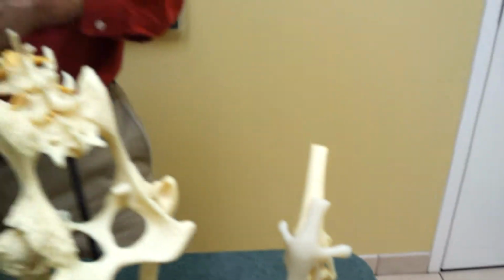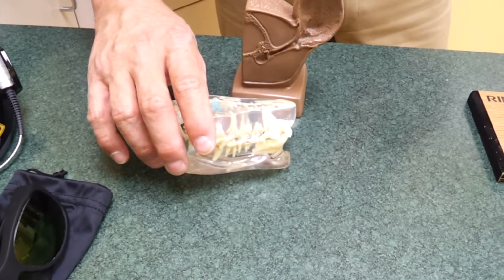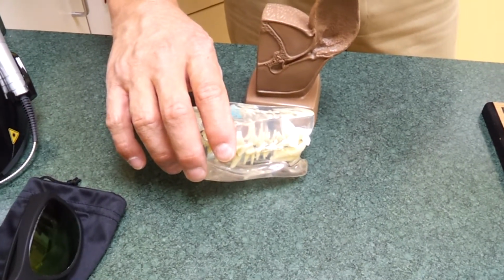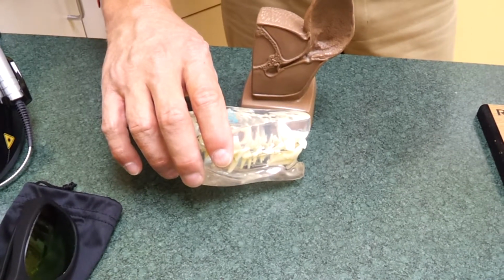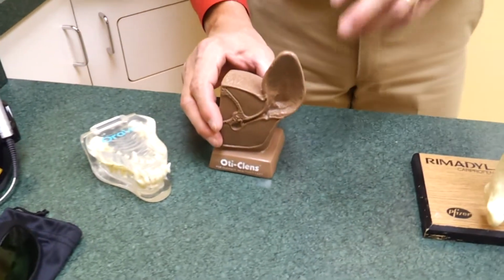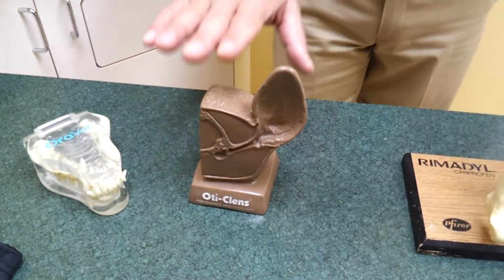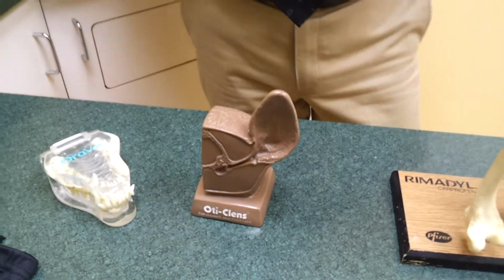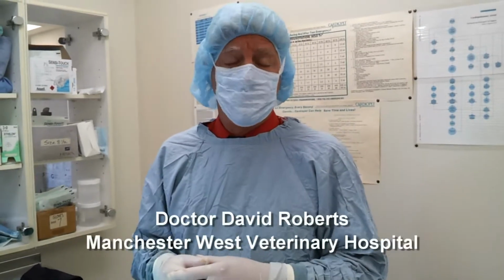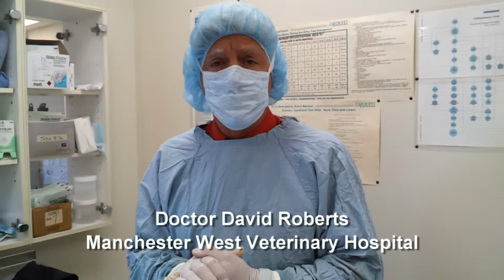We've used it after our dental procedures, so after cleaning, not a simple cleaning, but after what might be more of an uncomfortable teeth cleaning for a patient, or an extraction, we're using it for that. We're even using it for ear problems. And that has been an exciting area because there are some dogs that have to go through a very expensive and very painful surgery. Another use for the therapeutic laser is post-surgical or post-incisional.